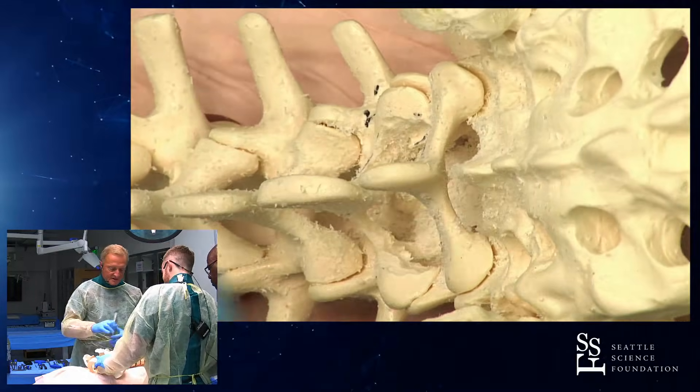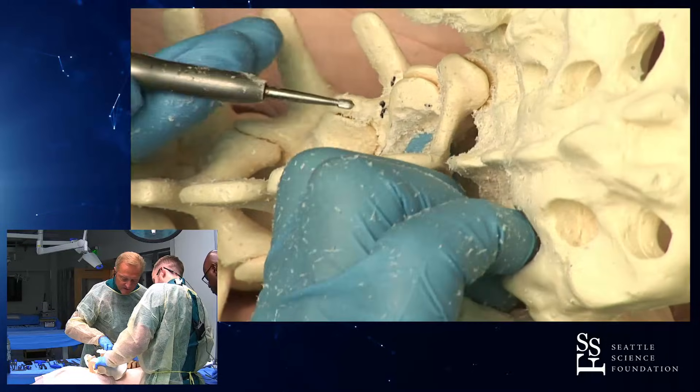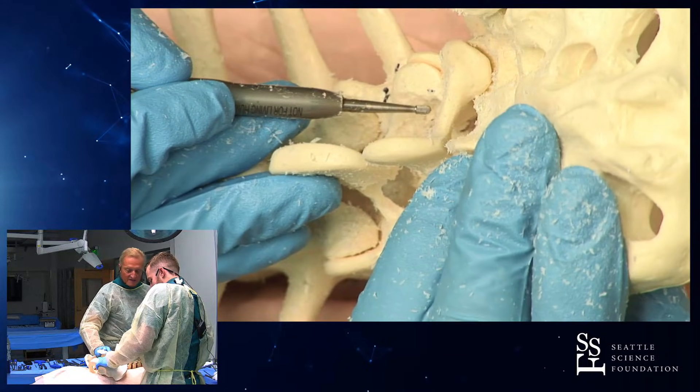Brooks is elegantly sucking this into the spinal canal. So you've mapped that out — you want to stay straight there. Take the entire superior medial half off.